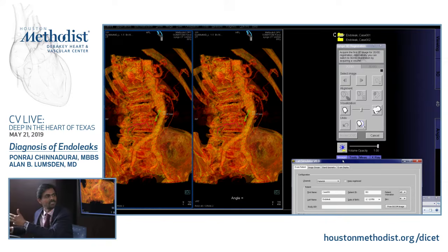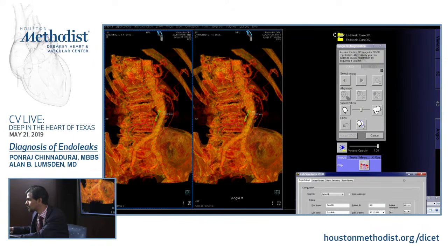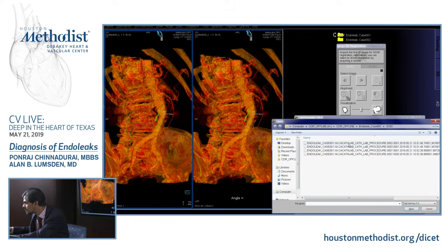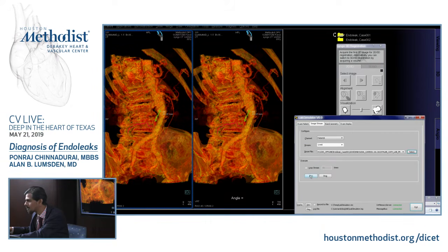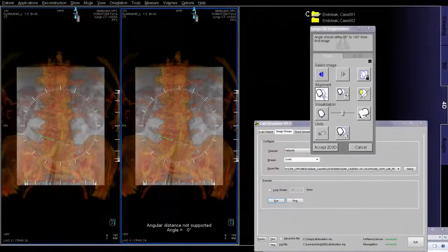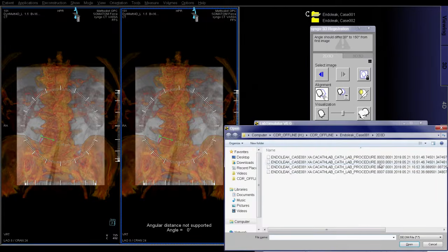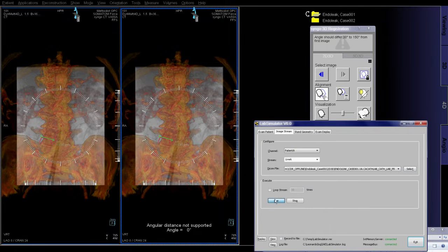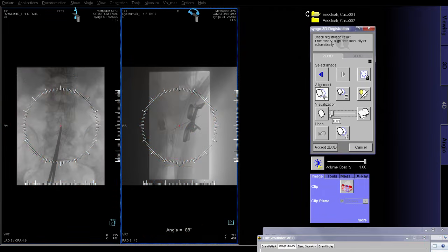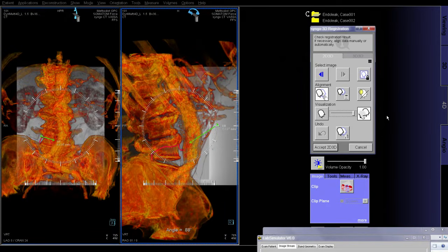where instead of having a CM, we are going to go through those two images that we have acquired. So this is the first image that I was talking about in a roughly AP projection. And now you oblique the C-arm and acquire the second image. And now you have two sets of images. So if I use my slider, this is your fluoroscopy from the day of surgery. This is the CT from 2 weeks before.